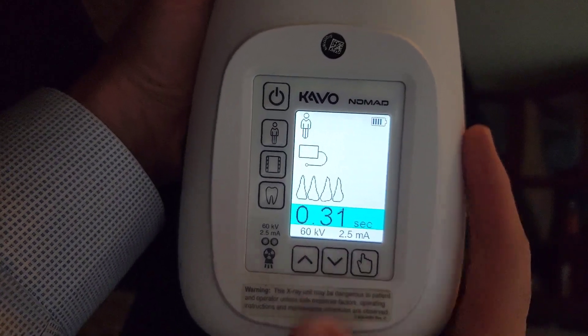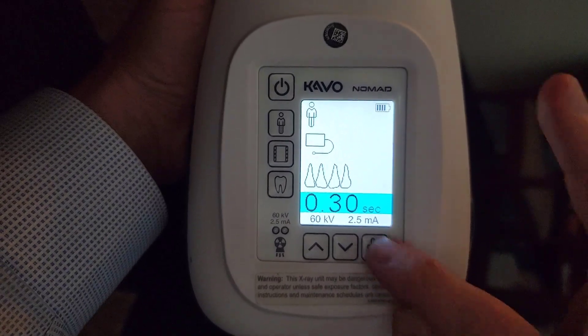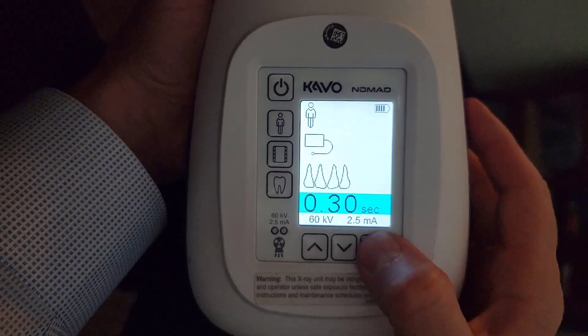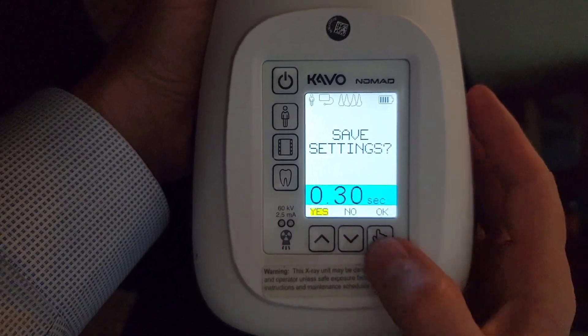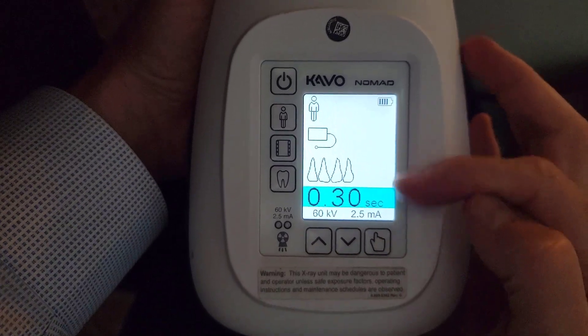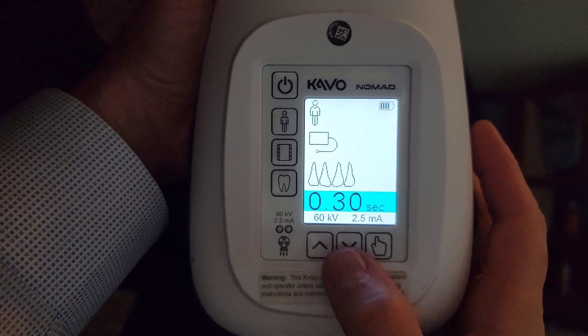I hold down the up button until I get to 0.3. This is the select button — you're just going to hit it once and then it asks you if you want to save settings. Hit the up button for yes, then okay — the select button again. And now that's reset the default setting for your anterior periapicals to 0.3. Just that easy.